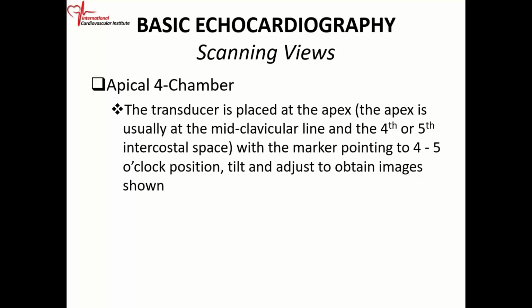move it to about the mid clavicular line. So you know the clavicle. If you make a perpendicular in the mid position of the clavicle and come down, you want to position your transducer in about the fourth or fifth intercostal space, along the mid clavicular line.